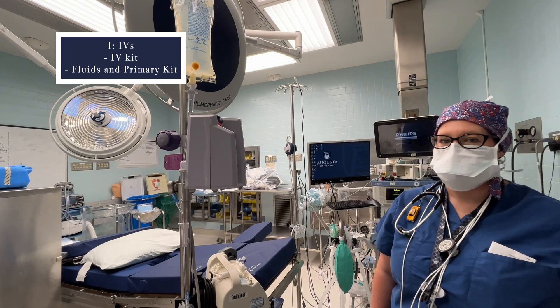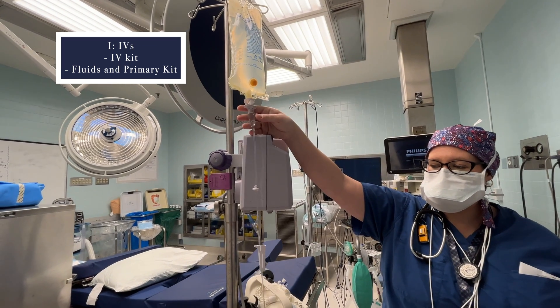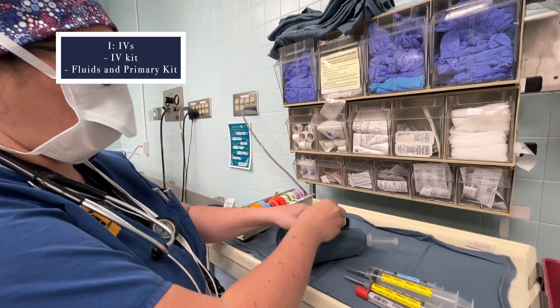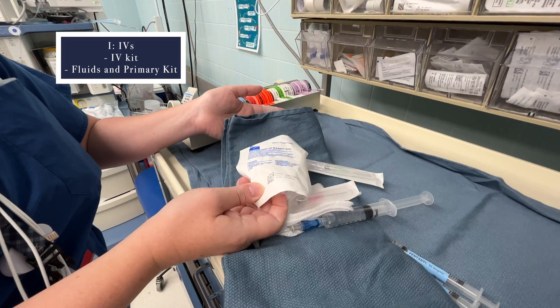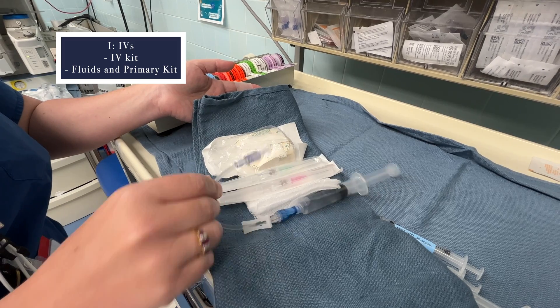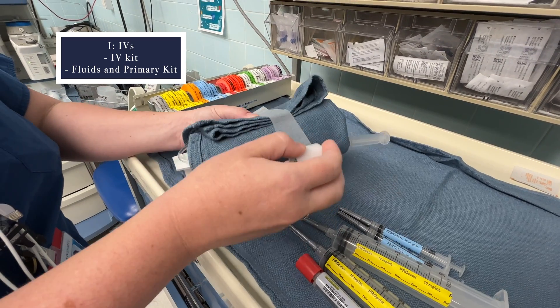On to our next letter, I for IV. I always like to start by setting up a clean fresh bag of LR with the tubing attached and primed, ready to connect to an IV if we need it. I also have my IV bundle prepared — all the supplies in one place for quick and efficient IV placement: your standard kit with a tourniquet and dressing, needles of different gauges, a flush syringe, extra gauze, and a roll of tape to secure it after it's placed.